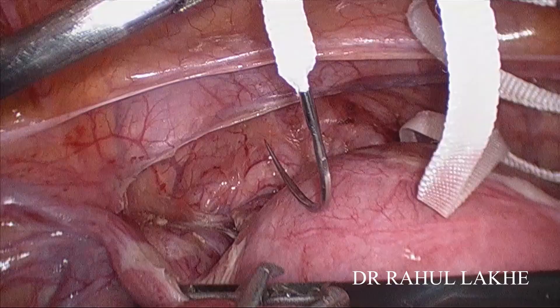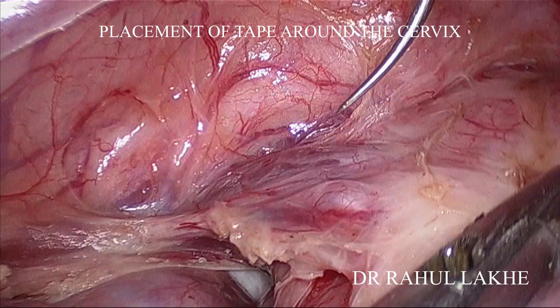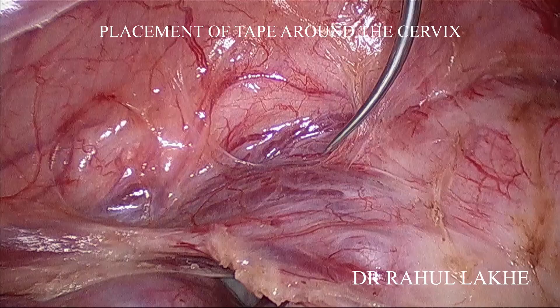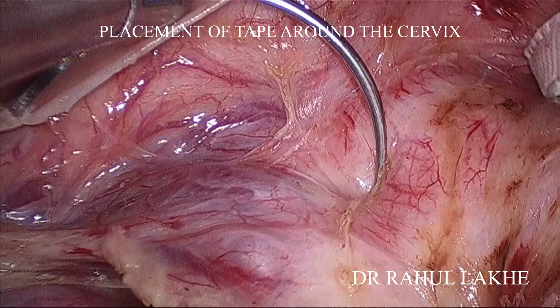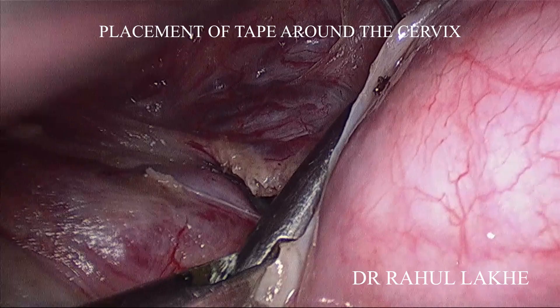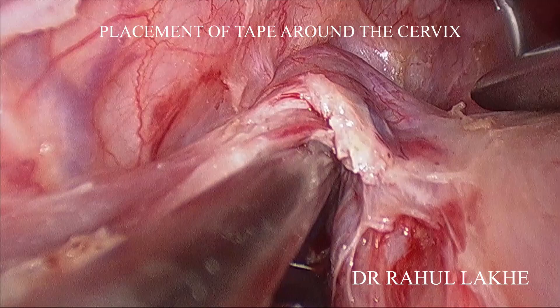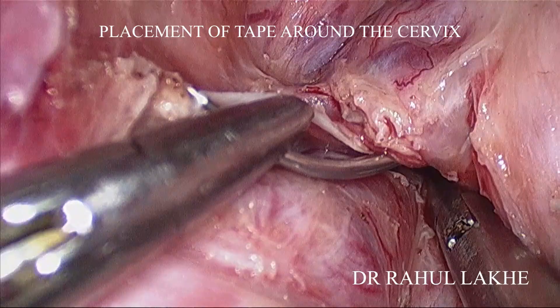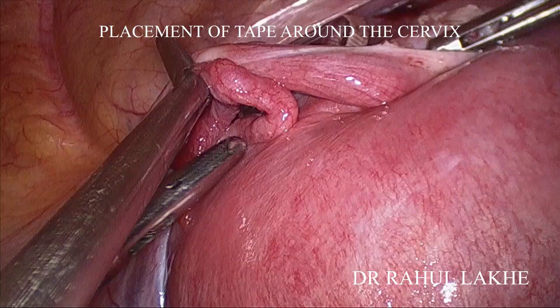The next step is putting the mersilene tape around the cervix. The needle grasps the anterior two-thirds and the posterior one-third. We are using a 5mm by 30cm mersilene tape. The needle is passed through the cervico-isthmic junction just medial to the left vascular bundle — you can easily see the pulsation of the left uterine artery. The needle holder in the left hand is of great help. It is passed through the left broad ligament window, helping in stabilization of the cervix as well as in passing the needle through the cervical tissue. The needle is grasped with the left needle holder and delivered out through the left window. The left adnexa is lifted and the mersilene tape is delivered out through the window.